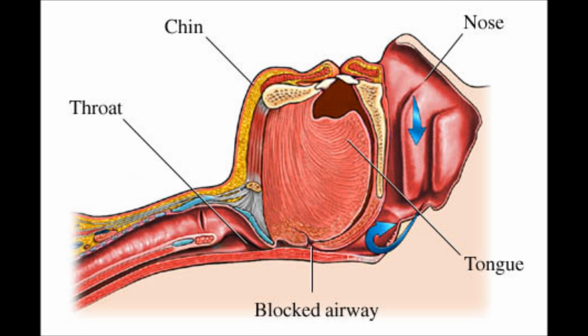NPA can also be used with patients who are neurologically impaired with poor pharyngeal tone or coordination leading to upper airway obstruction.